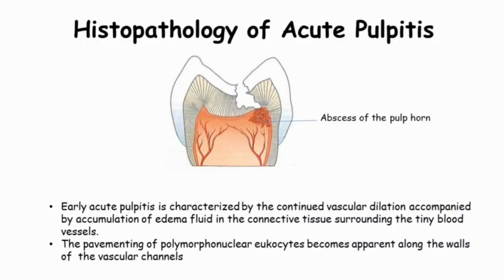Today we are going to see about histopathology of acute pulpititis. Early acute pulpititis is characterized by the continued vascular dilation, accompanied by accumulation of edema fluid in the connective tissue surrounding the tiny blood vessels. This is the abscess of the pulp horn.